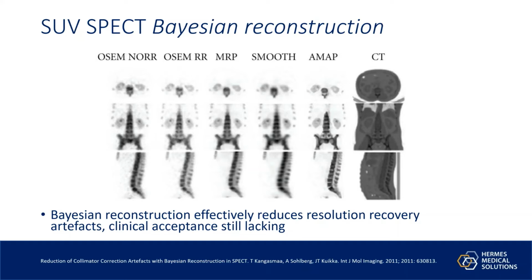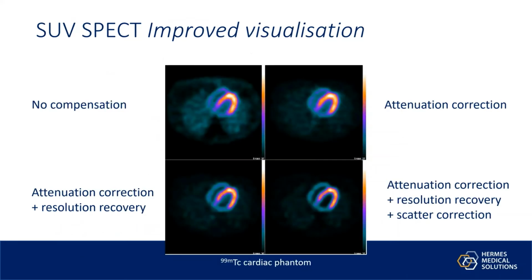We've got a few examples here of how this looks on clinical data. The paper concludes that Bayesian reconstruction effectively reduces resolution recovery artifacts, but clinical acceptance is still lacking. That was the case back in 2011. I think it's still true now.